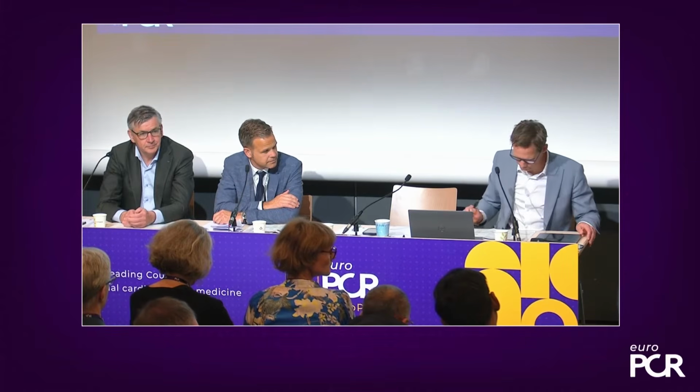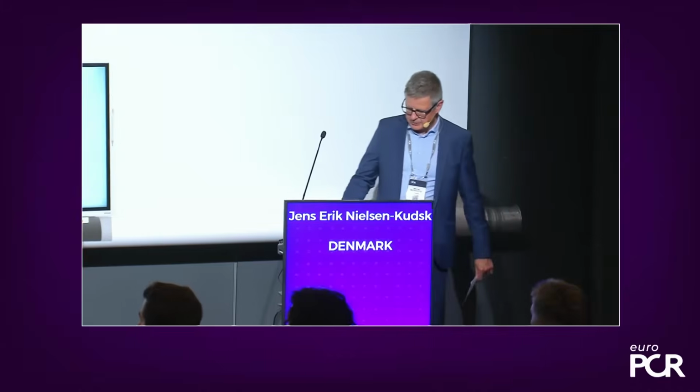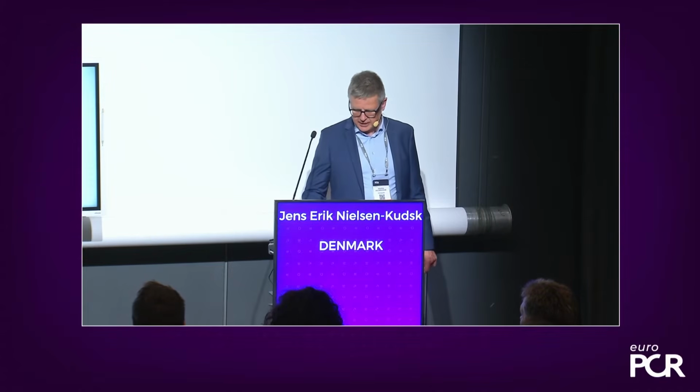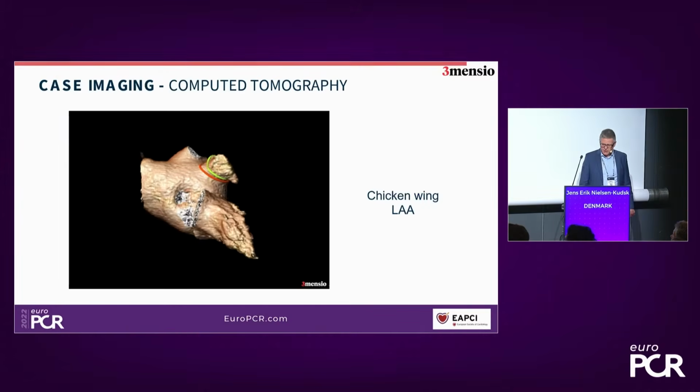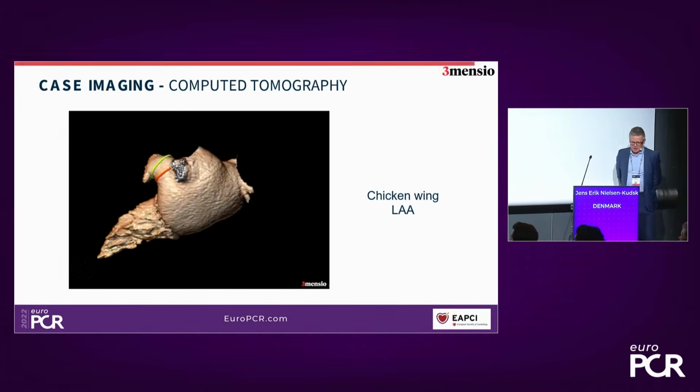Thank you. And this patient here, our gentleman with ICH, he was admitted to the Heart Center in Copenhagen, and let's see what they decided to do. So they took him for pre-planning and did a cardiac CT scan.